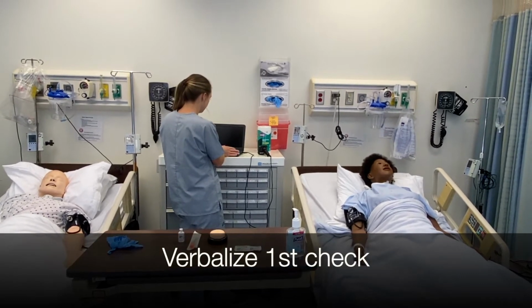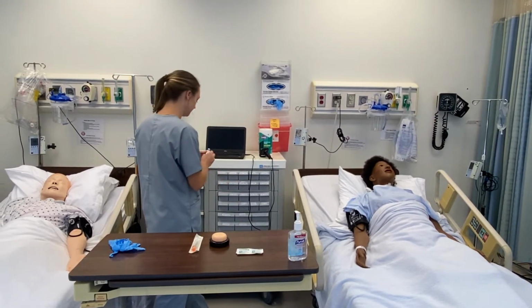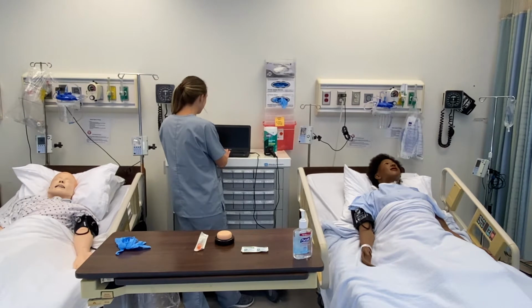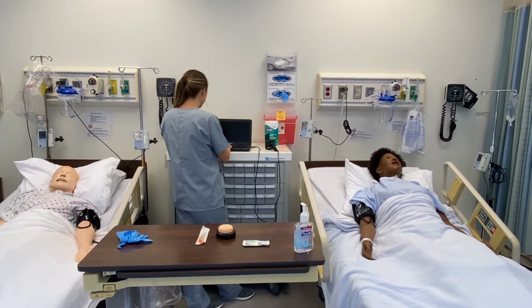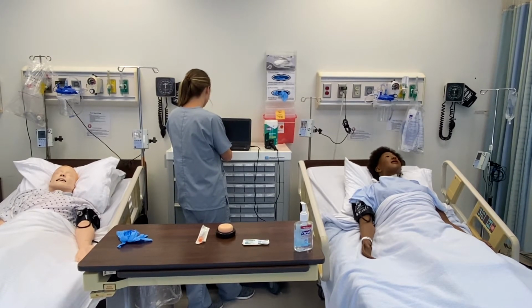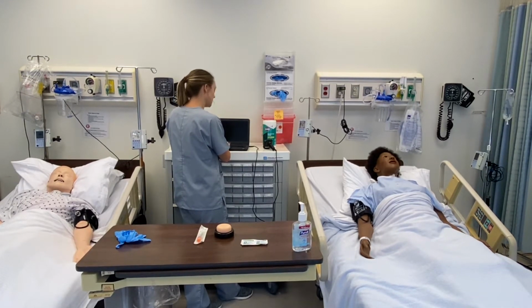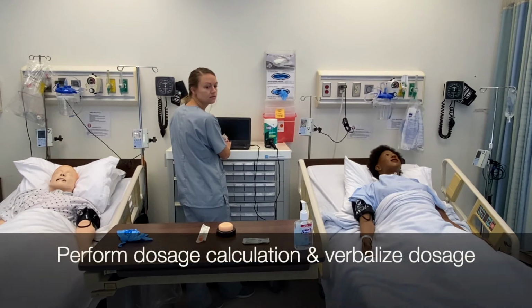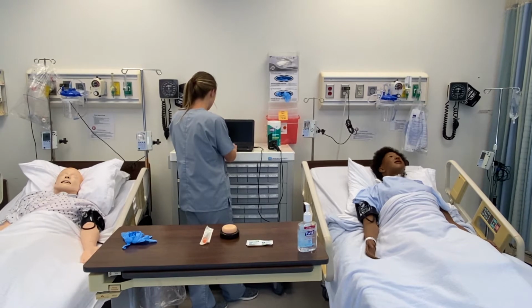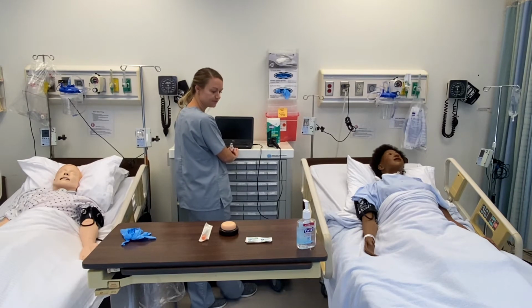Verbalize first check, including reading the EMR order, comparing the medication label to the order, selecting the proper medication ordered, and checking the expiration date. So I'm looking at my EMR, and there is an order for NPH, which is what I have. The amount is 10 units per 250 for her glucose, and the expiration date isn't until 2024. Perform dosage calculation correctly and verbalize dosage. So this patient is going to get 10 units, which comes out to 0.1 mLs.